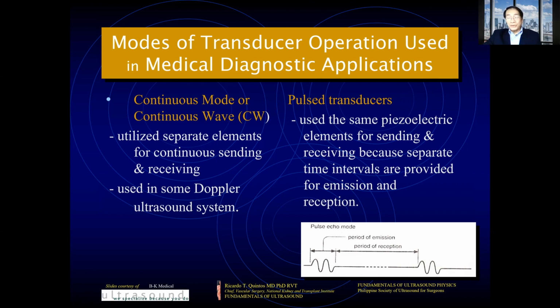So the pulse transducers will pulse and then listen, will transmit and then listen. And so it is up to us to apply the settings of the pulse on how long a period of time that they will pulse and how long a period of time that they will listen for the echoes. And again, in the lecture on knobology, you will be told how this is very important in adjusting now for the improvement of the detection of the ultrasound.